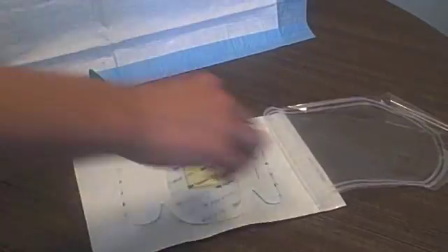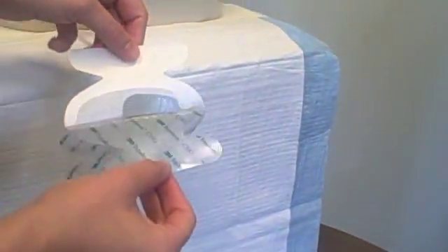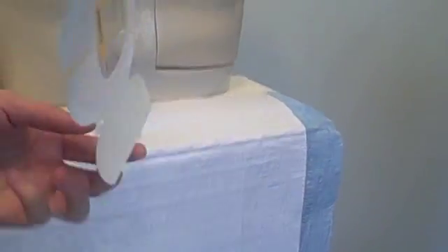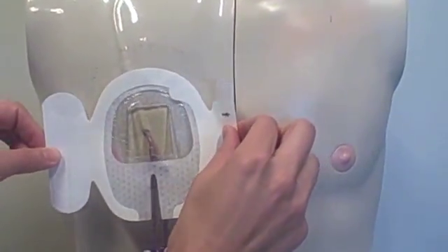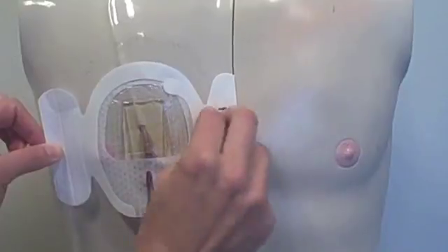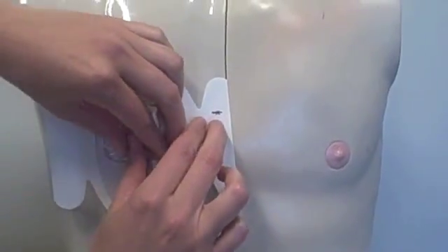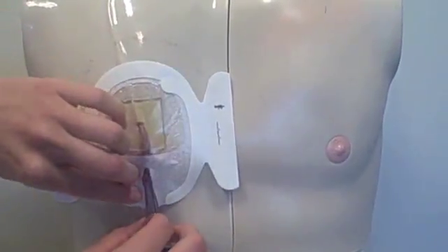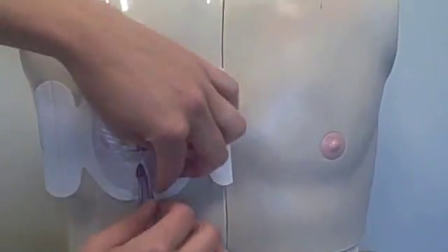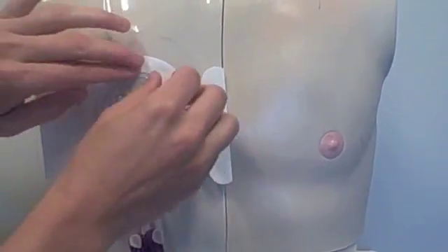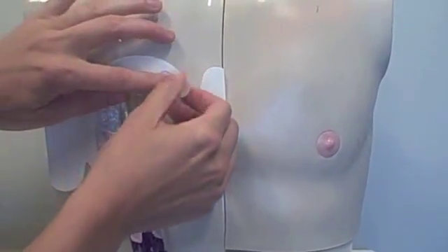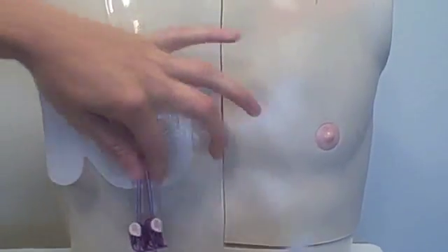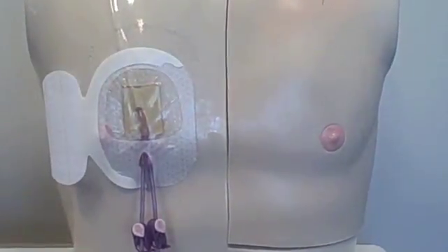While the No Sting Barrier is drying, carefully remove the paper backing of the transparent dressing. While holding the wings of the dressing, center the gel pad over the insertion site and place it on the skin with the notch edge down toward the lumens of the catheter. Be careful not to stretch the dressing when applying it. Once the dressing is in place, remove the white paper border that is on top of the dressing. Smooth out the transparent dressing to remove wrinkles.